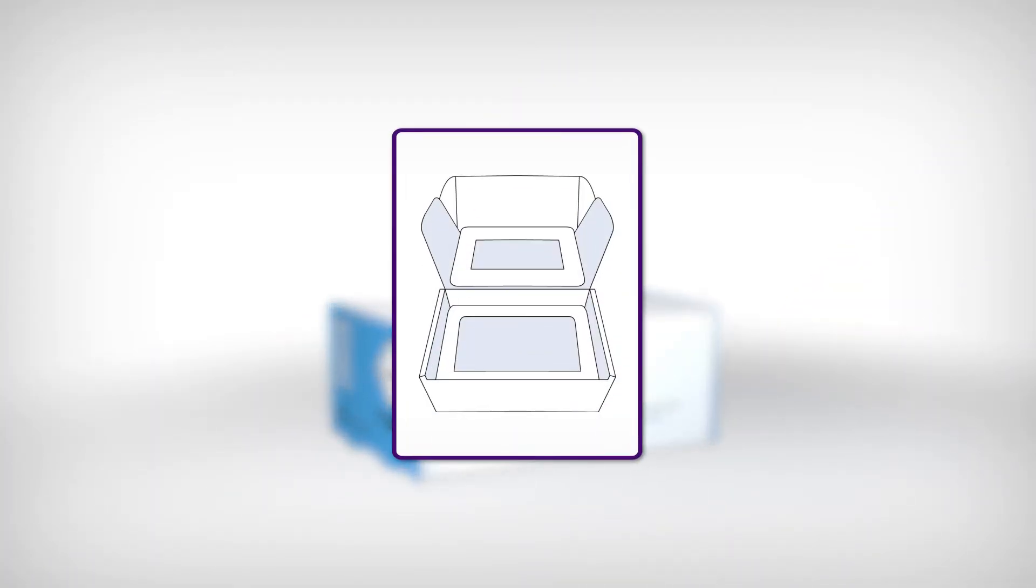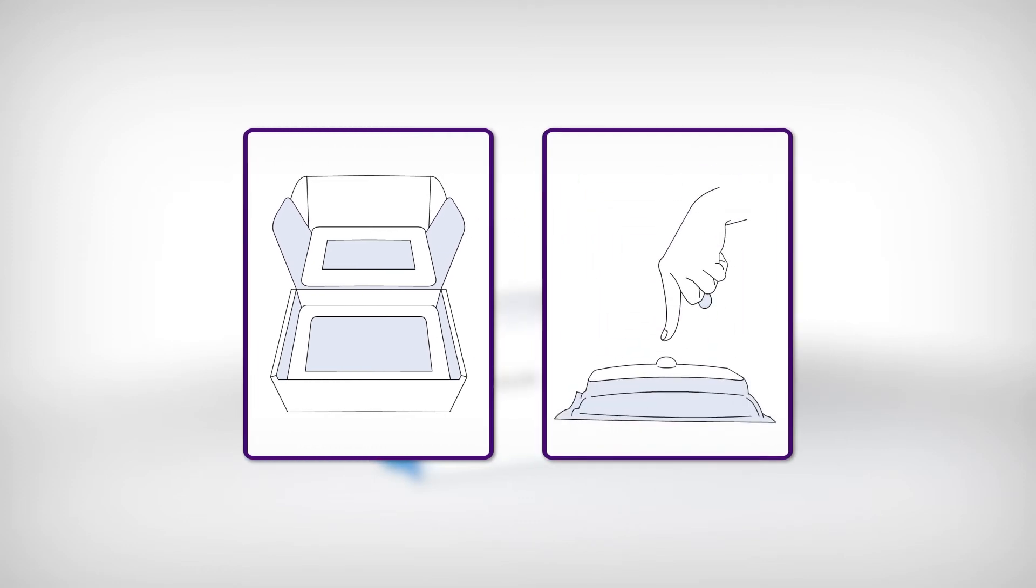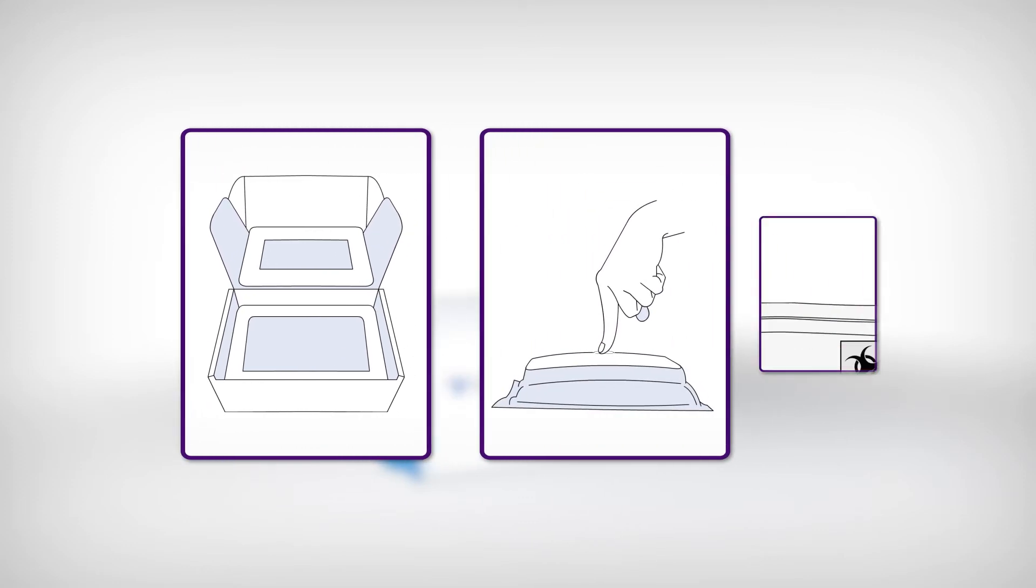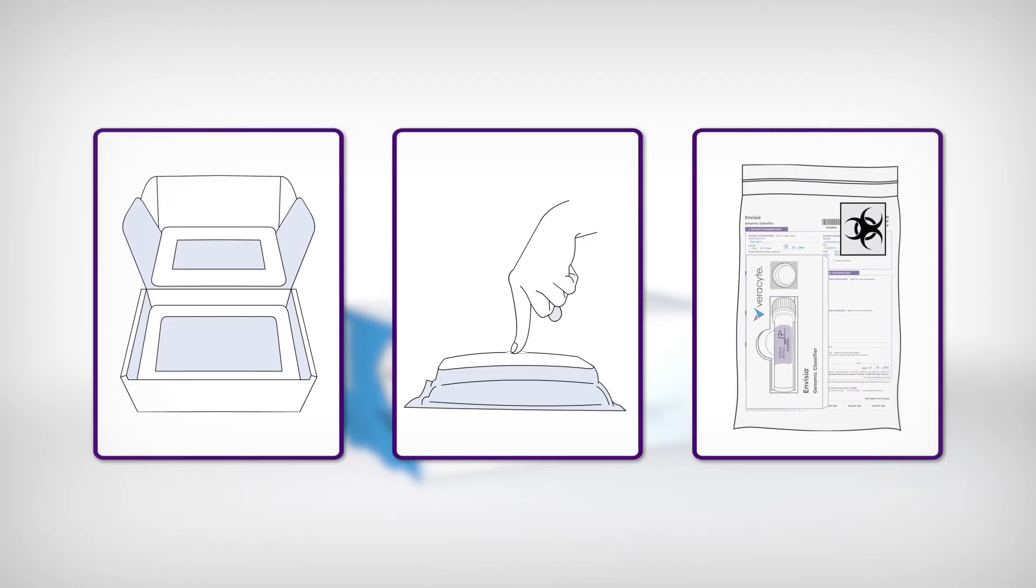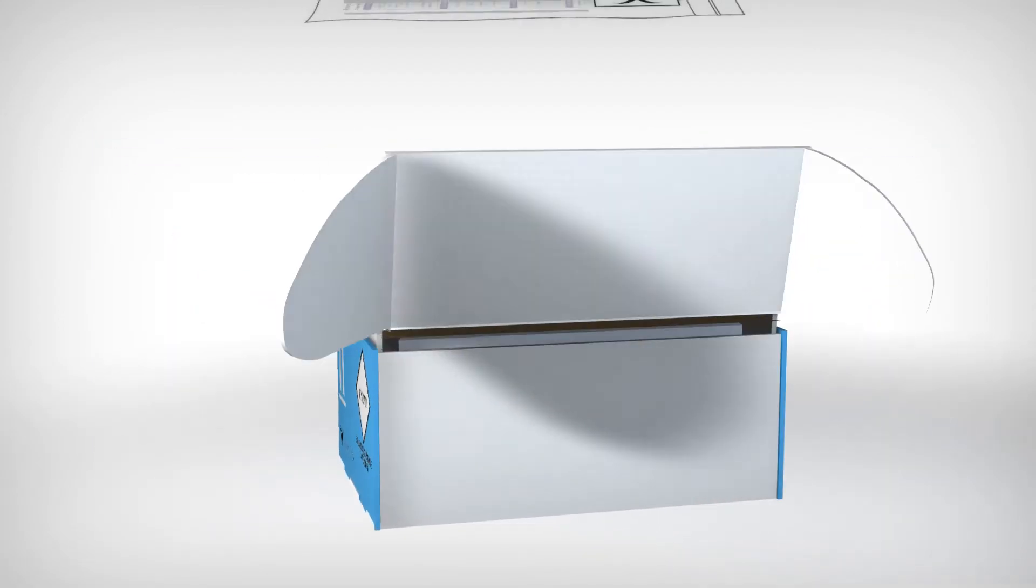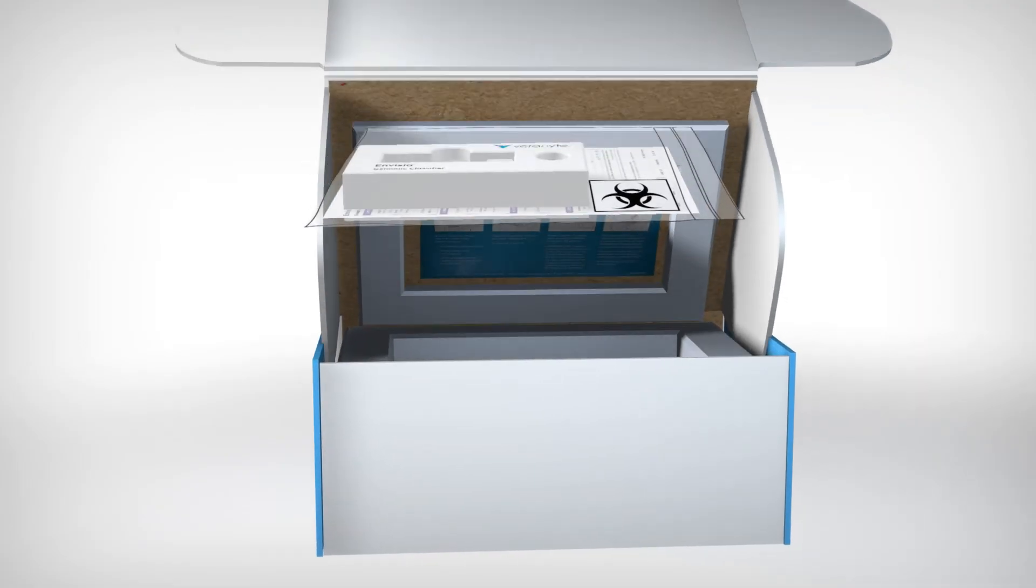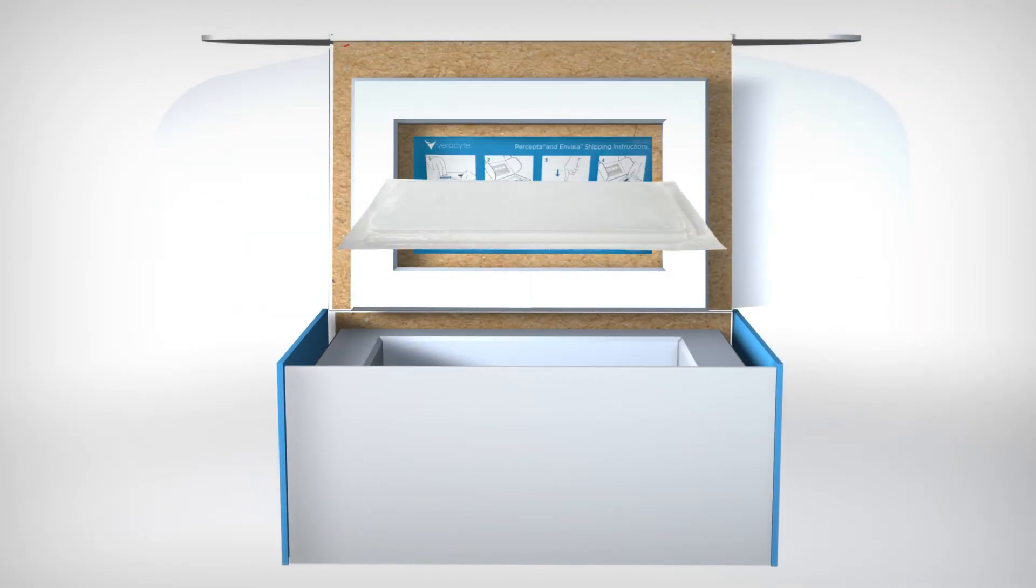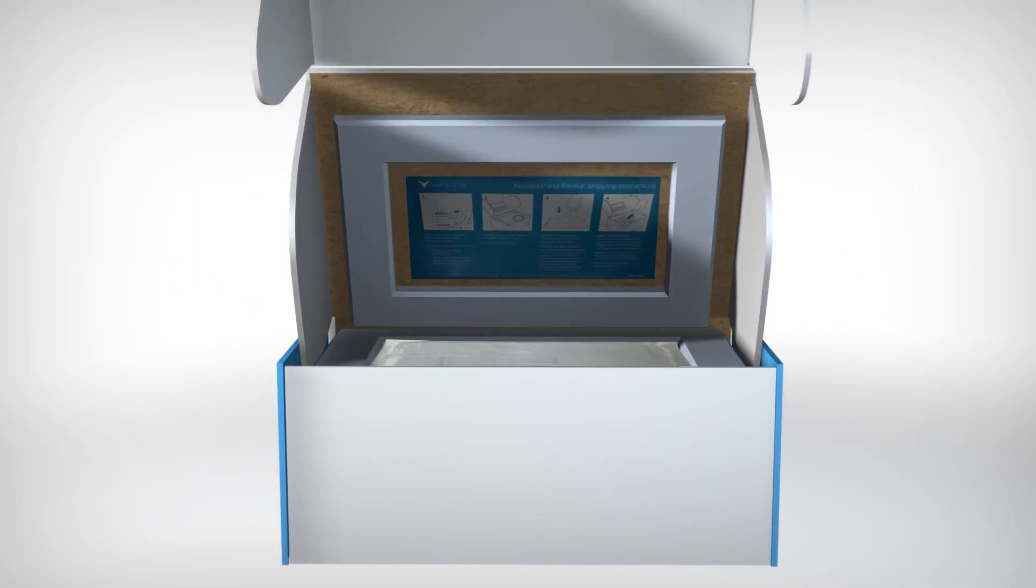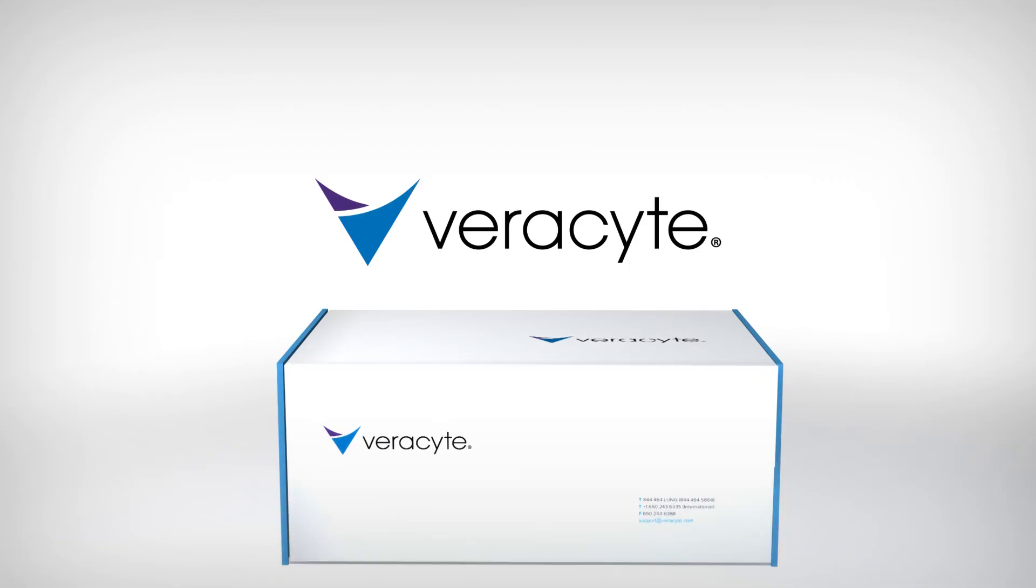Activate the cooling pack when ready to ship the samples by pushing down on the button located in the center. Place the biohazard bag in the provided nanocool. Place the cooling pack button side down over the plastic pouch and send the package to Verisite's clinical laboratory.